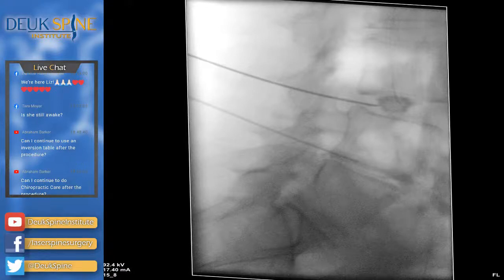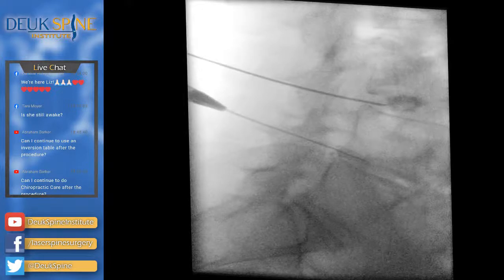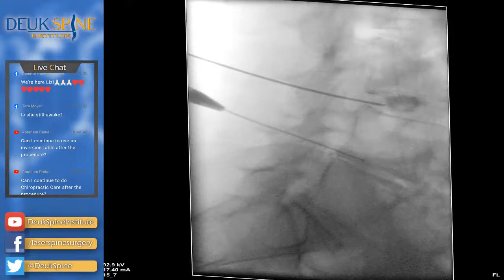Are you saying I got in the wrong hole, Luis? Yes? That's what you're saying. The wrong hole. No, that is a problem. All right, let's get this in the right hole. Lay still. She's a little bit awake. You're doing great. Just lay still. Let me know when I can proceed.